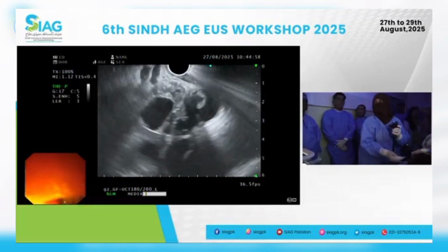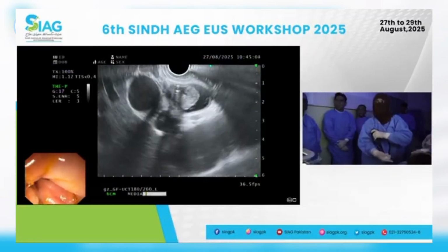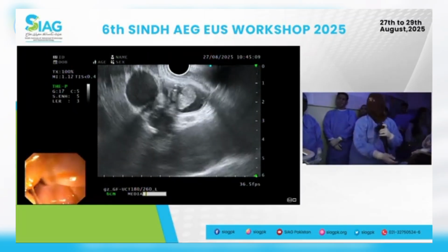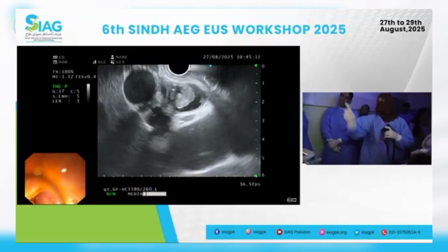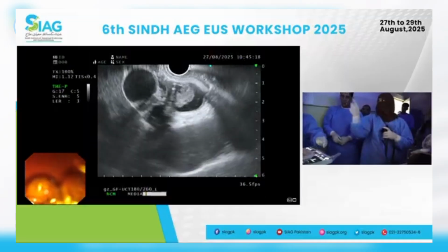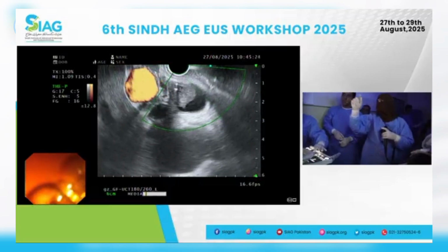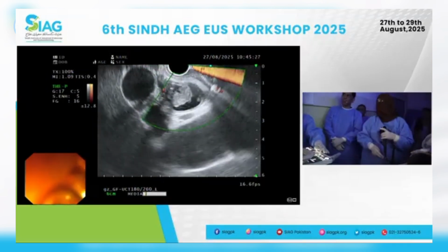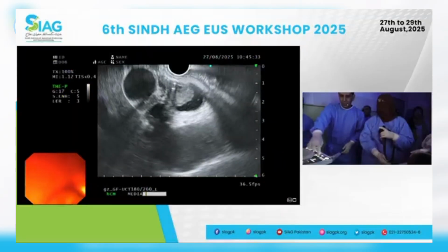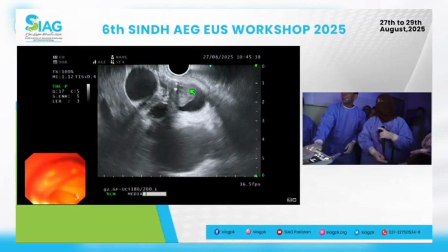Good. So small wheel to the right. Good. You can stay there. Definitely some obstruction. Good. So what do you see? Probably a vessel. And this one is, I think, CBD. Good. Excellent. And the CBD with the stent in. This is the portal vein. Good. Portal vein and then the CBD with the stent in situ. And then obviously surrounding the stent there's a lot of debris. Where's the pointer gone? Exactly. So all this is sludge with a stent in situ.